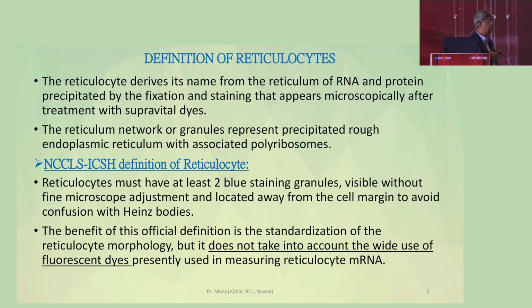The benefit of this official definition is standardization of the reticulocyte morphology, but this definition does not take into account the wide use of fluorescent dyes that we are using presently in measuring reticulocyte RNA. So this definition is not addressing the fluorescent dye which we are using.